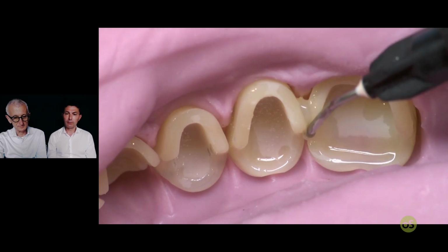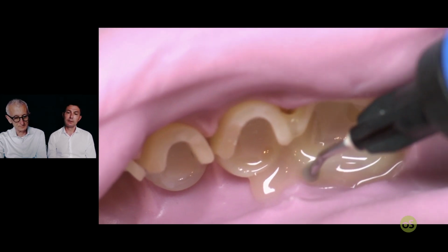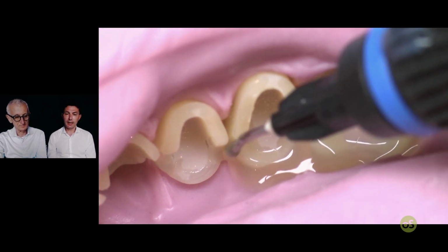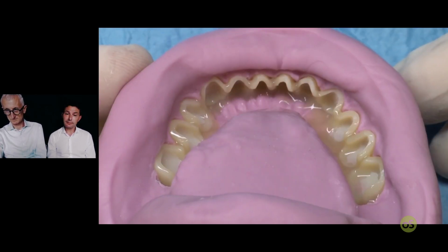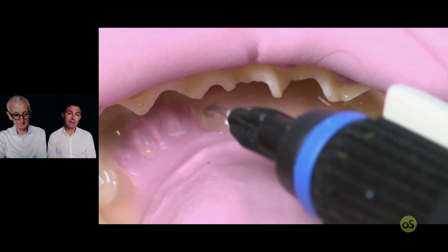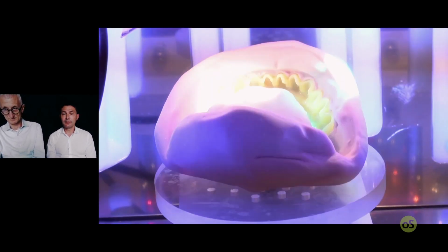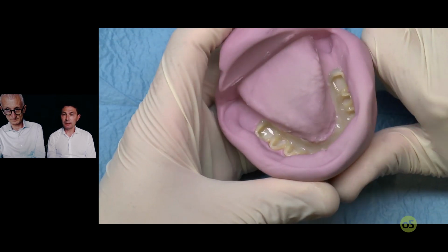with a flowable enamel or dentin, or some neck if you want, depending on the area. The big advantage when you use only the veneer is the space, because you have the empty space immediately.